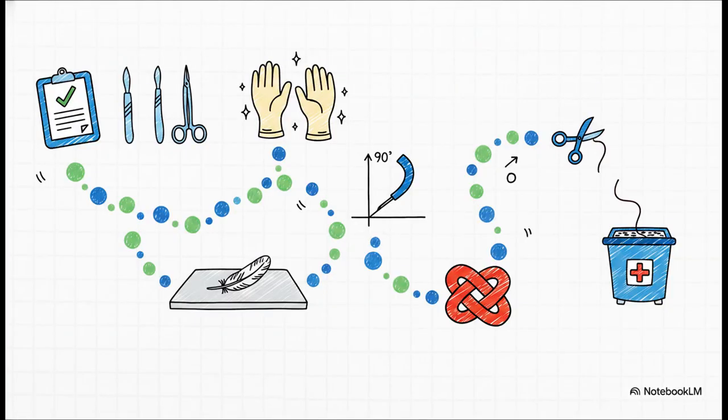Now, during those middle phases, deconstruction and comprehension, it is absolutely vital to explicitly cover the specific technical requirements. We're not just talking about pushing a needle through skin here. It's a whole process. It starts way before you touch the patient, with getting informed consent and preparing instruments. Then it's about maintaining aseptic technique, handling tissue gently, and getting that perfect 90-degree needle entry, which is usually the very first thing students forget when the pressure's on.